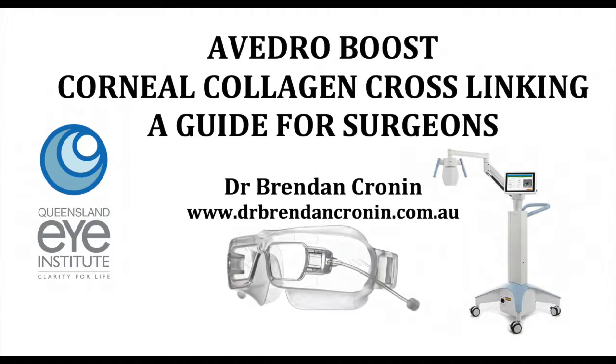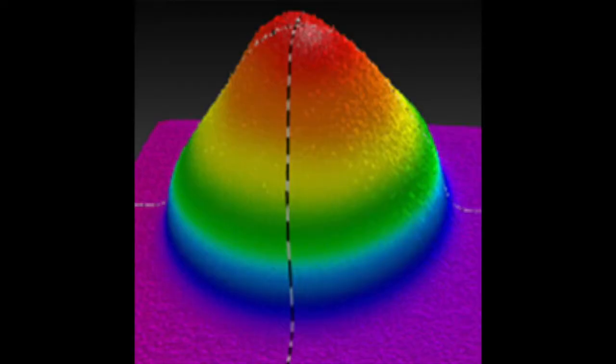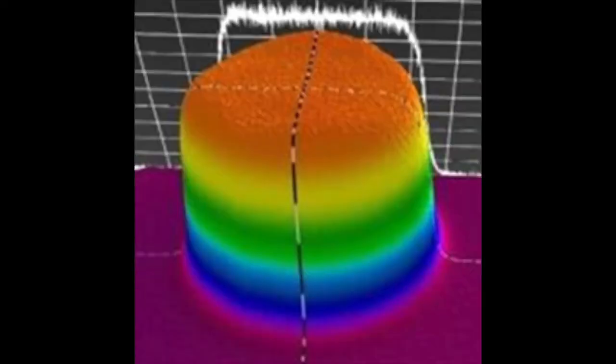Hi, this is Dr. Brendan Cronin from the Queensland Eye Institute, giving some tips for surgeons who are looking at starting the Avedro Boost collagen cross-linking procedure. It's the Avedro KXL2 machine — a fabulous machine. We all know why we use the Avedro machines: they have a great top hat profile without the hotspots that other machines can have.